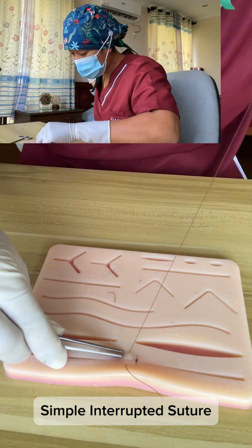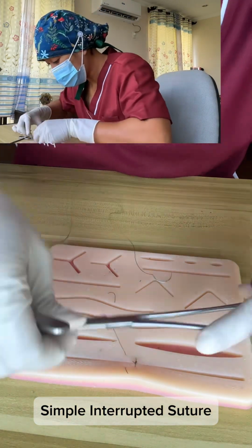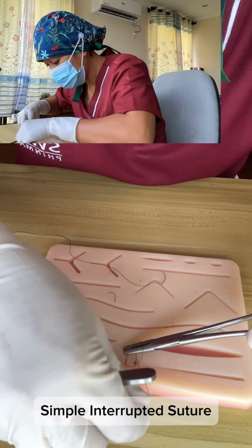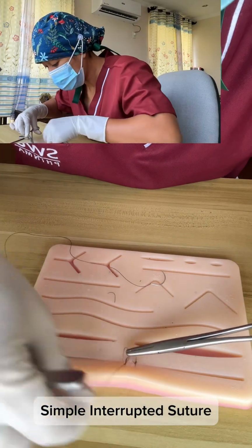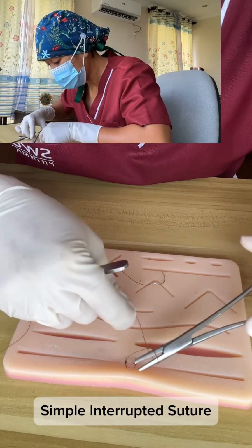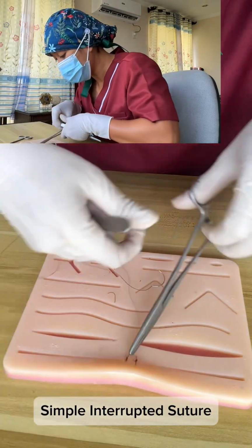Each stitch is independent, so if one fails, the rest still hold, which is ideal for tissue under moderate tension. Therefore, it is versatile, secure, and promotes accurate healing across different tissue types.